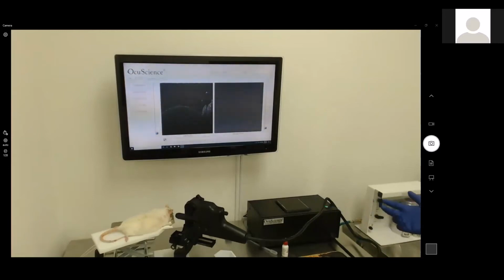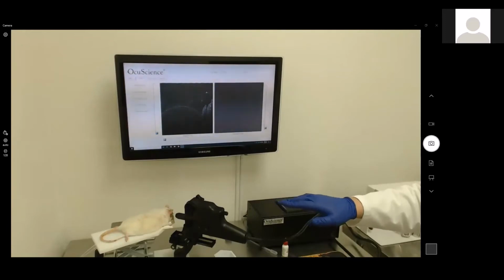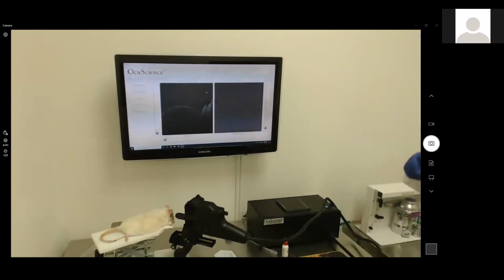The 512 images we're able to put into a free software, ImageJ, and capture 3D images, as Daniel had mentioned. We'll get in and we'll actually look at the retina of this rat here. And then after that, we'll go in and take some images and put it through and show how to get a 3D and what we've actually gotten on some of our 3D images.